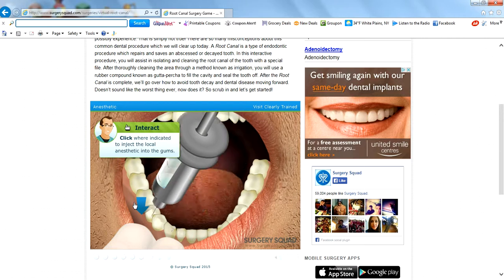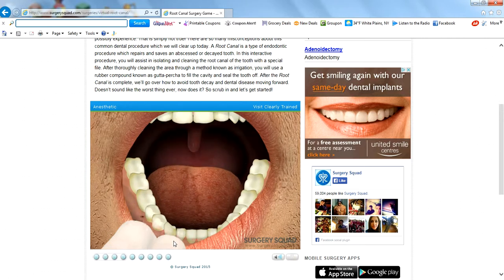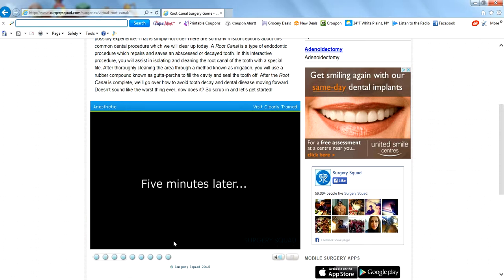I'm spitting everywhere. Oh, bro. Let's give our patient a few minutes to relax and for their mouth to become completely numb. Oh, no, not the needle. Oh, five minutes. Yeah, please.